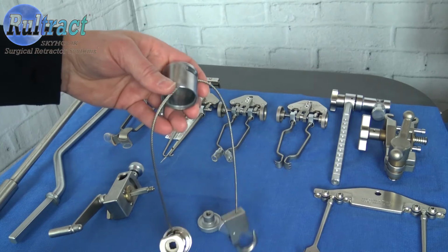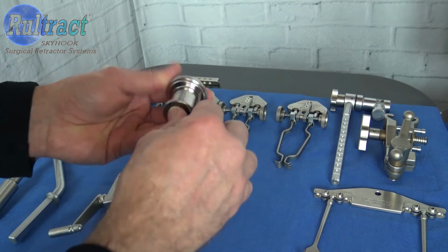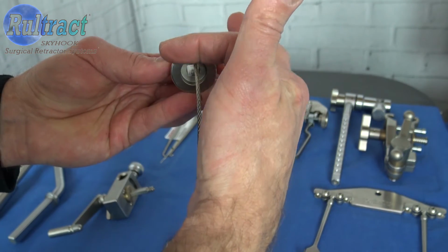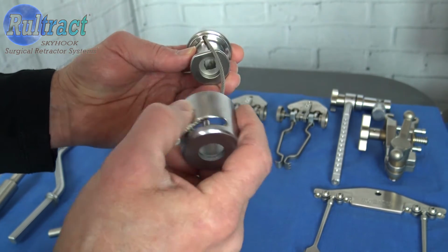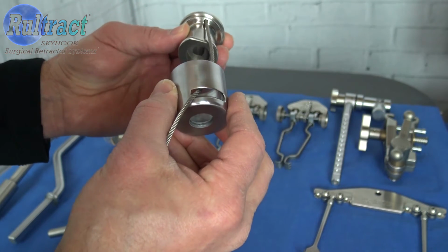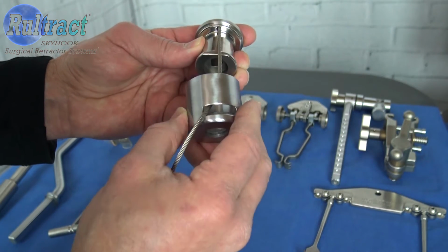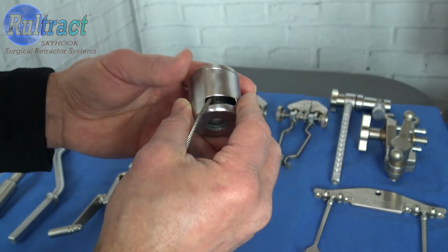Next, we're going to reassemble the 3 pieces of the spool cap assembly. So you'll want to be sure to note that there's a flat surface on this spool. Let the cable hang over the flat surface. Then you're going to align your cable guide, which is a groove that's cut into the spool cap, with that flat surface and the cable. So these 3 pieces go together with the flat surface, the cable, and the cable guide lined up. Then they go together very easily.